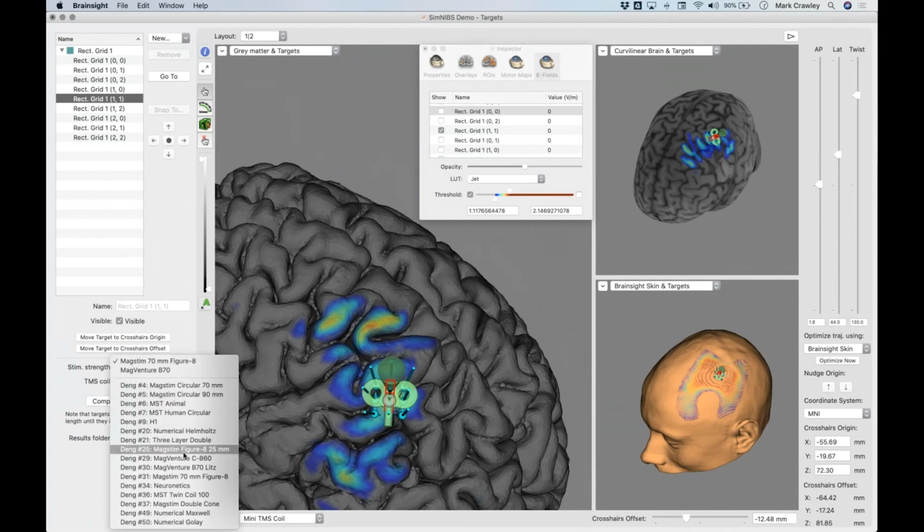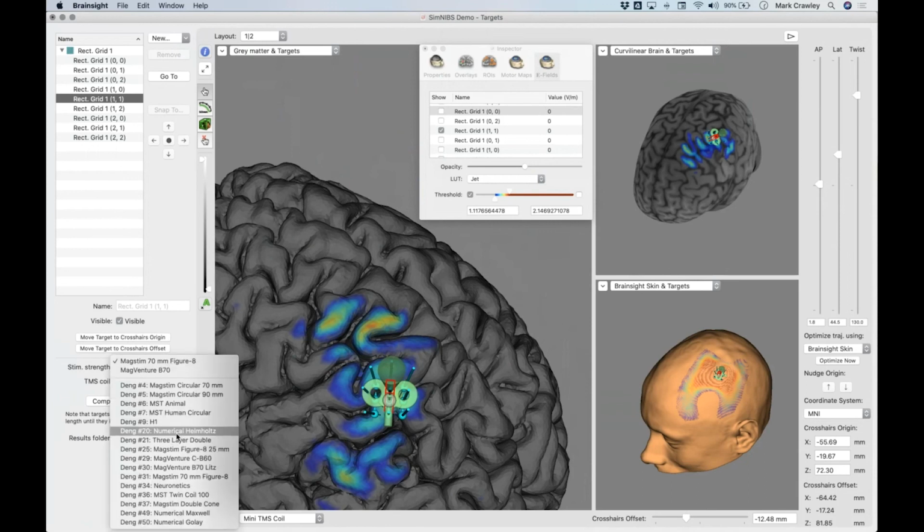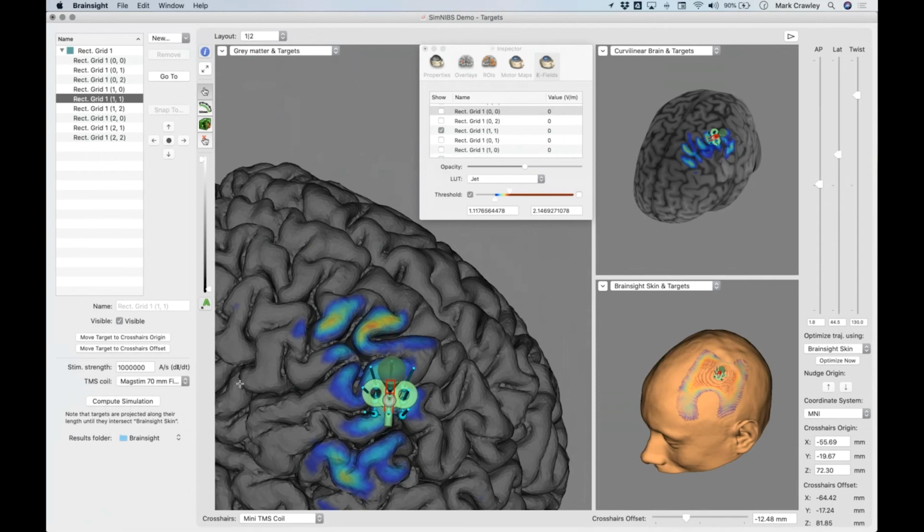So that's how they were done. Whether or not Rock used his new device to do the rest of these is a mystery to me. But yeah, these measurements are specific to coils. There's also a great paper. Well, I can't remember who it's by right now, but it's a good reference. I'll find it and I'll share it.